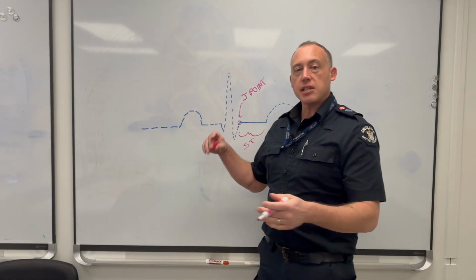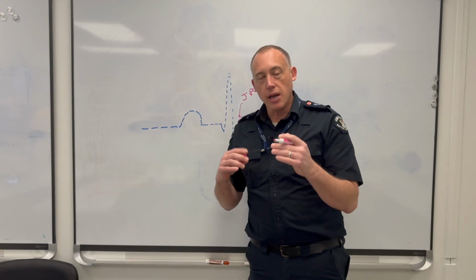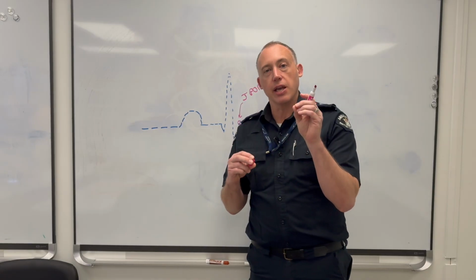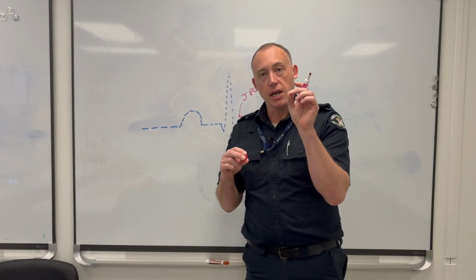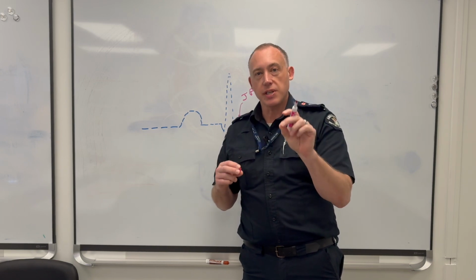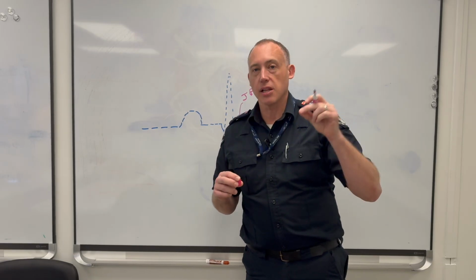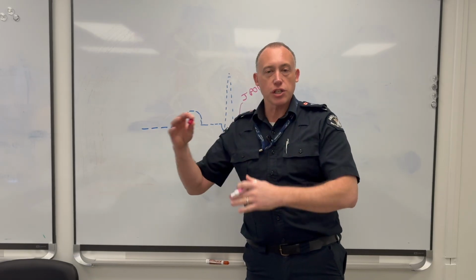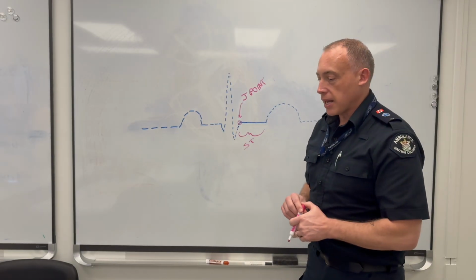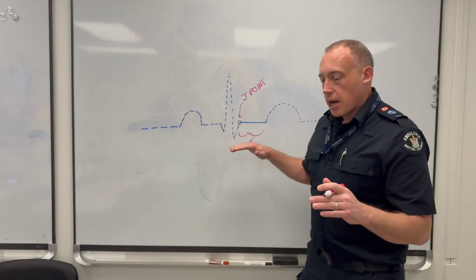When you have an ST segment that's elevated and an S wave that maybe has a different morphology, it can be tricky to figure out where that is. So it's important to take your time and look in a lead or look in a couple of different leads to determine exactly where you think that transition from the S wave to the ST segment is, because that's the basis of what we use to determine ST elevation or depression, as well as the shape and everything of the ST segment. And like I say, we'll talk about that later. Not much else to say.